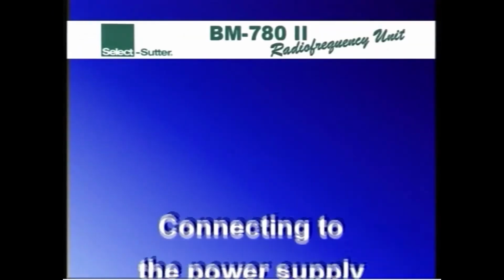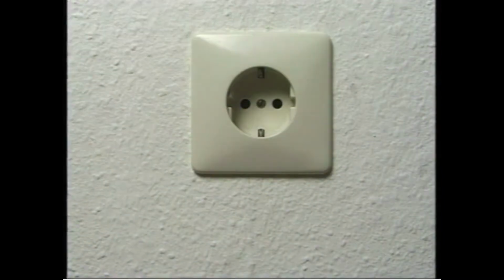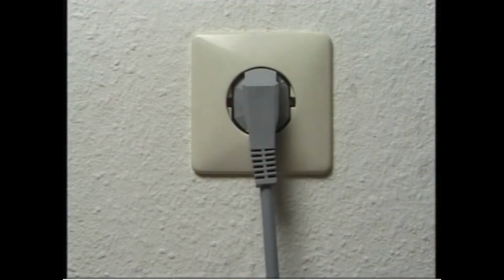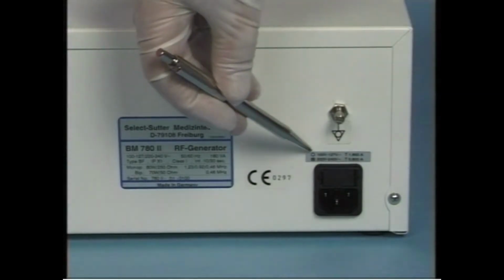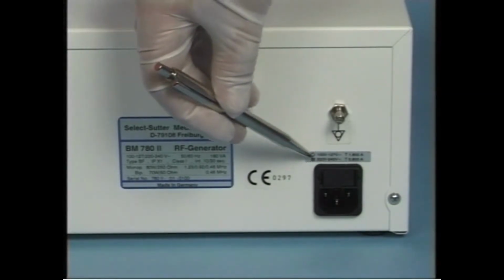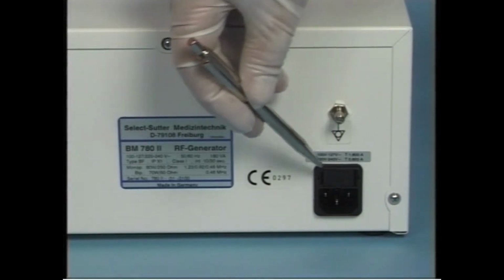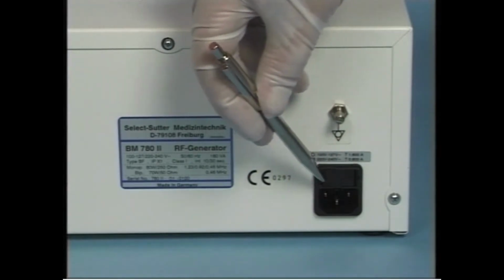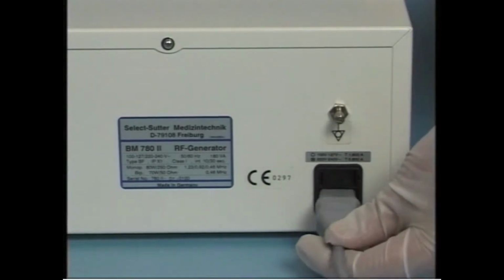Connecting to the power supply. The generator must be connected with an approved terminal plug to a grounded or earthed electric socket. You should check beforehand to ensure that the voltage indicated on the device indeed corresponds to your power supply. A safety fuse is built into the device's connecting socket for the power cable. Place the power cable plug in the appropriate socket on the back of the device.